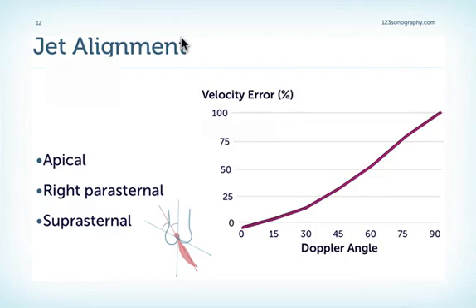When examining a patient, it's very important to get good jet alignment of the Doppler jet to the aortic valve velocity stream. To achieve that, we have to use several Doppler windows — always start with the apical view, then turn to the right parasternal, and finally try the suprasternal window to get the maximum velocity. Remember, gradients are calculated from the maximum velocity, so if we don't find the maximum jet, we will have too-low gradients. Keep the Doppler angle as low as possible to get the lowest velocity error.